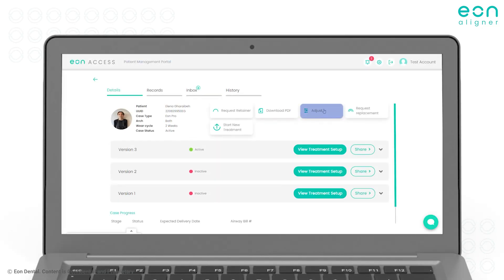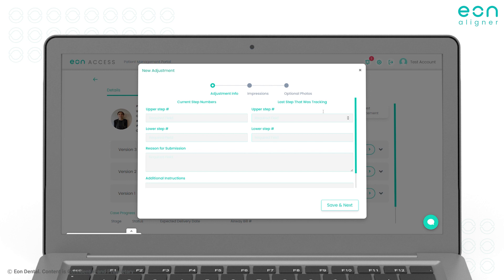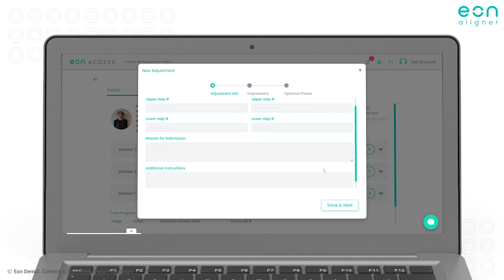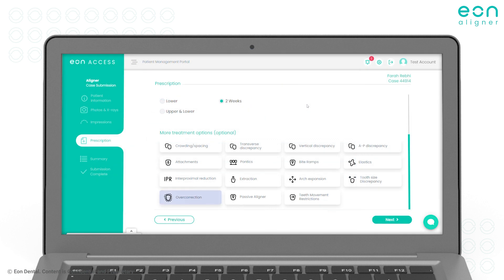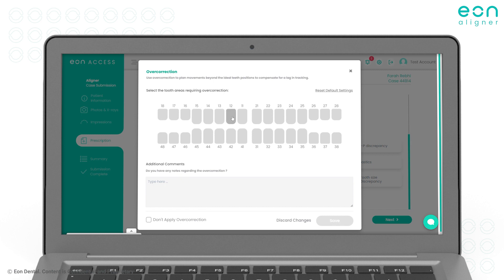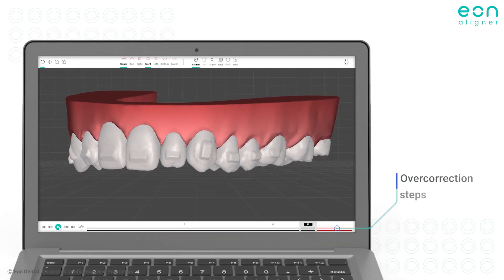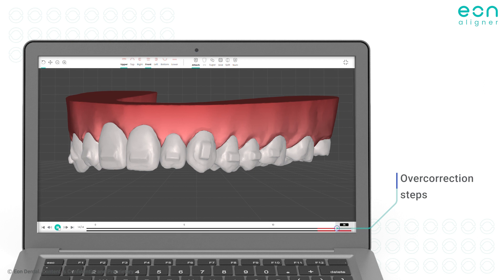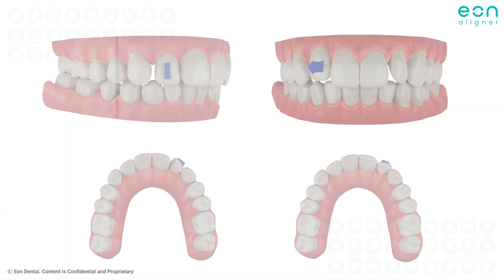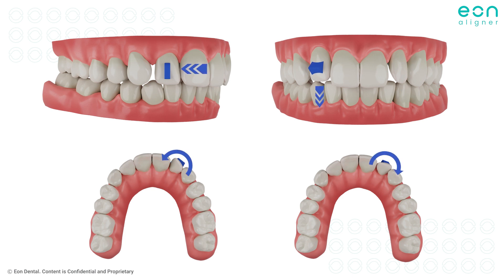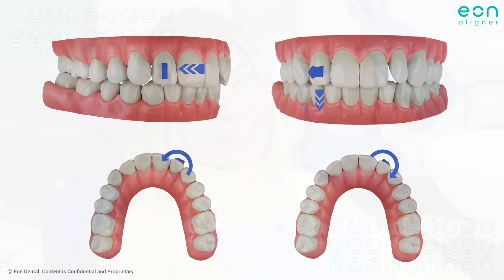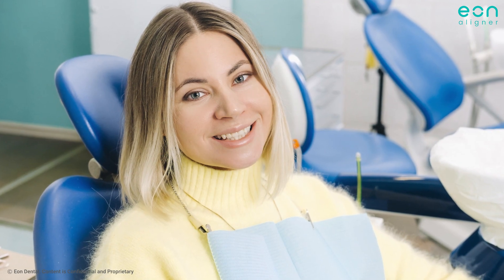And finally, requesting adjustment for finalizing the alignment of less tracking teeth can always be the way to proceed, especially when multiple other movements will still need to be addressed in a refinement plan. One helpful tip, however, is to plan some overcorrection steps during refinements for the less tracking movements. Overcorrection steps are simply meant to move the teeth slightly beyond their target position to accommodate the lag in tracking. Incorporating these strategies with EON aligners can greatly enhance the success of lateral incisor tooth movement, providing optimal alignment and a confident smile.